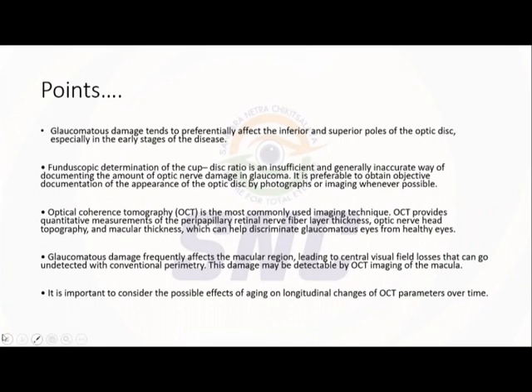And OCT also, I just want to highlight. Whatever you mentioned, SD OCT of ONH, RNFL, and GCC, sir, just focus on these three things whenever you have time. Not like OCTA. OCTA is also important, but it is not widely used and accepted for glaucoma.